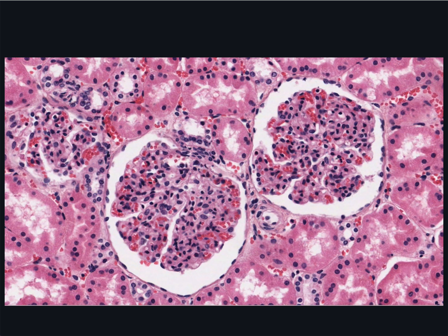They're lined by cuboidal cells, and because they have an extensive brush border of microvilli, their apical borders look very messy. Due to their active role in reabsorbing most of the fluid from the ultrafiltrate, they contain huge numbers of mitochondria, which imparts this eosinophilic or pink stain to the cytoplasm.